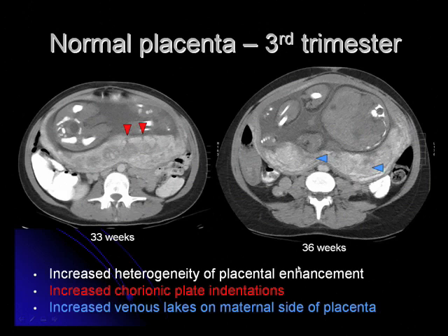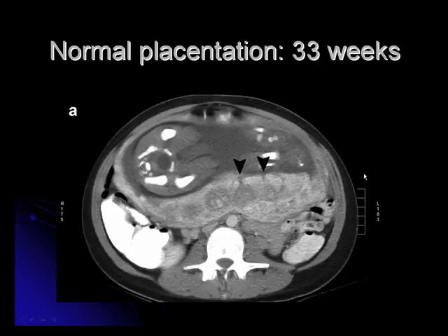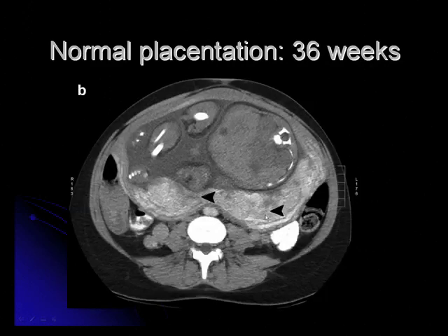These are some images demonstrating the normal appearance of the placenta during the third trimester. At 33 weeks, the CT scan shows increased heterogeneity of the placenta compared with the second trimester, as well as the formation of chorionic plate indentations on the fetal side of the placenta. Also, there are increased venous lakes on the maternal side of the placenta, shown as hypodense areas within the placenta. These are blow-up images of the chorionic plate indentations and the venous lakes. These are all part of normal placental development.